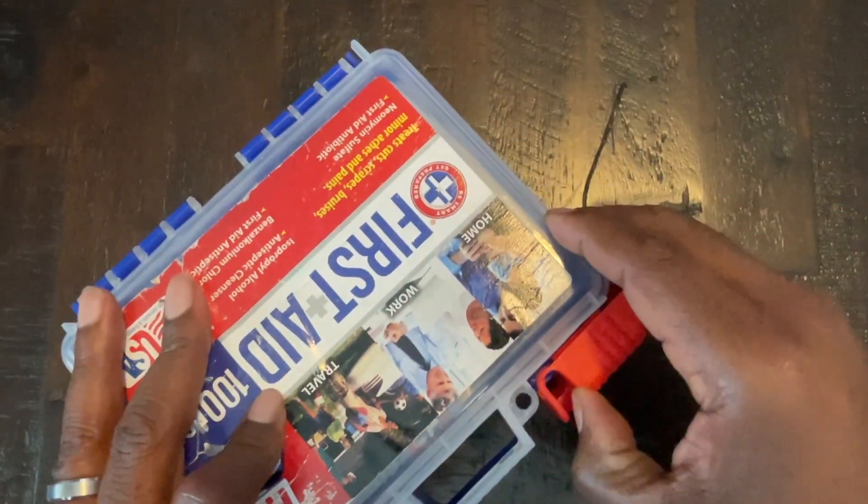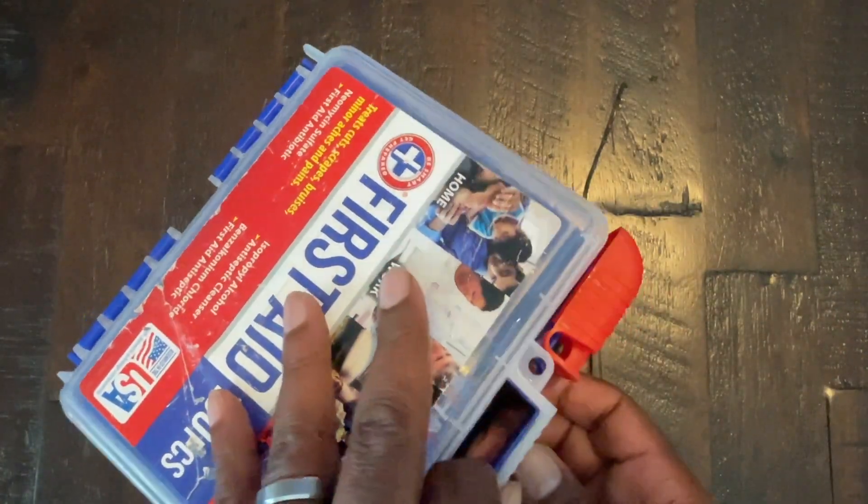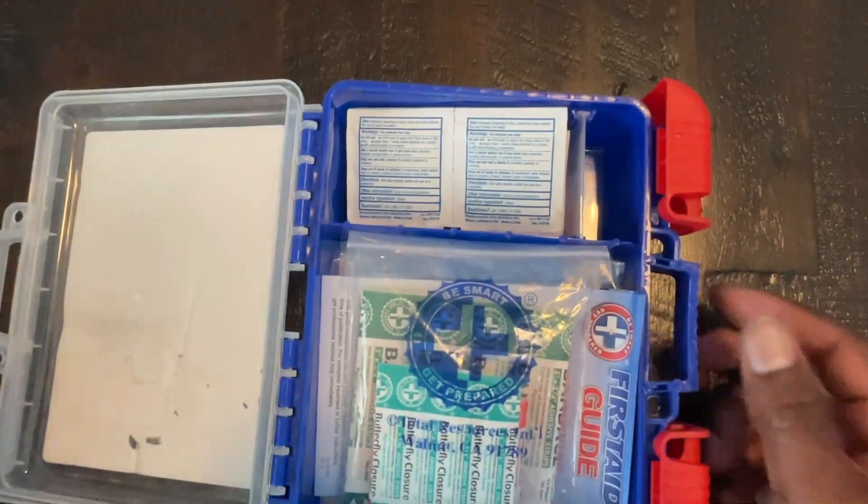I have had to use the band-aids a couple of times, so it has come in handy. But this is what the kit has in it.